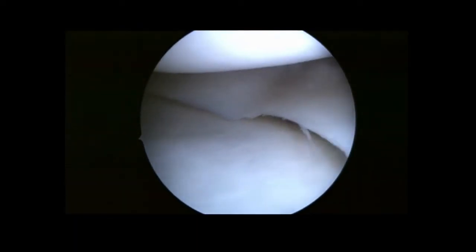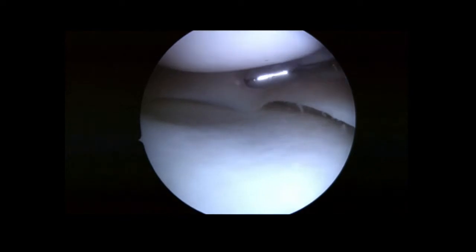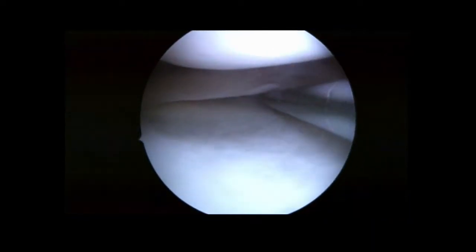This is a left knee medial compartment view through the anterolateral portal. This patient had a history of deep-layer sprain of the medial collateral ligament with persistent medial compartment pain and meniscal positive signs.